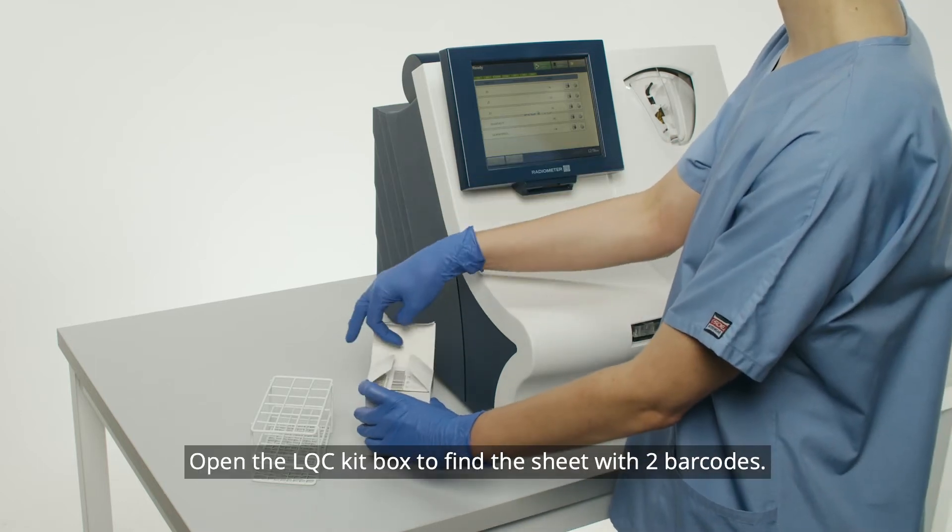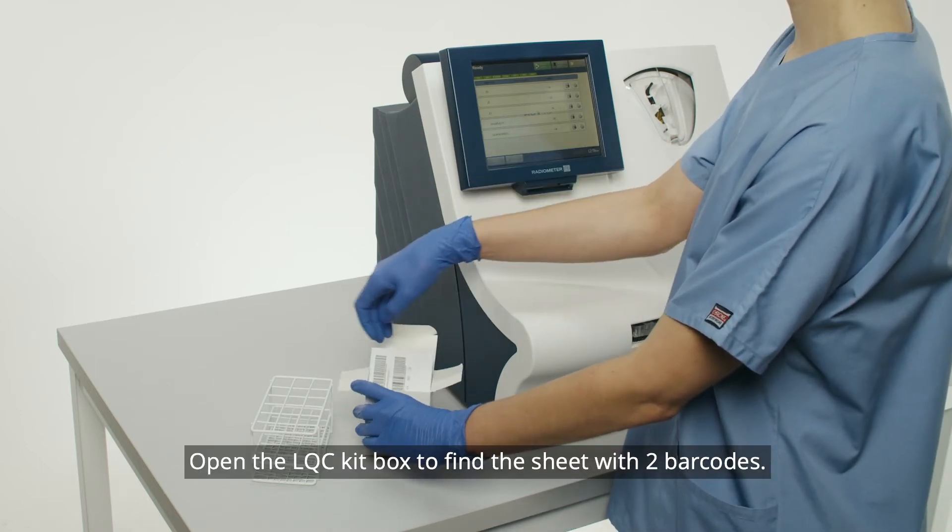Open the LQC kit box to find the sheet with two barcodes.